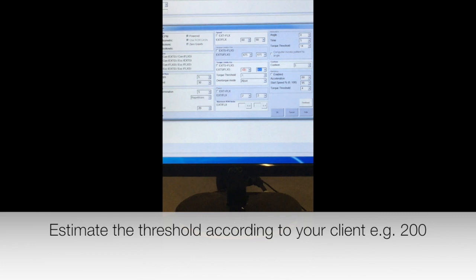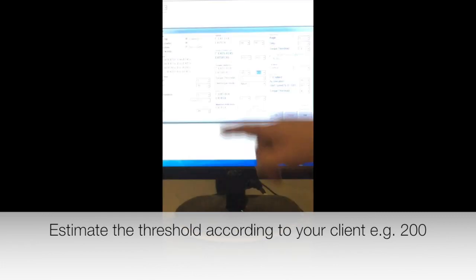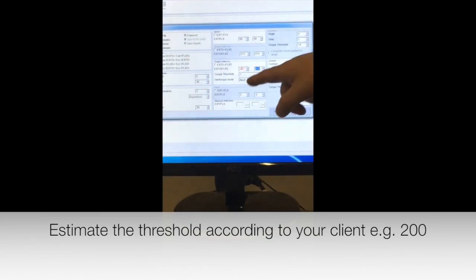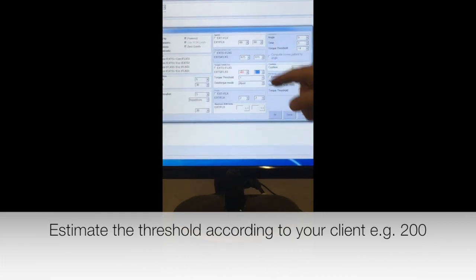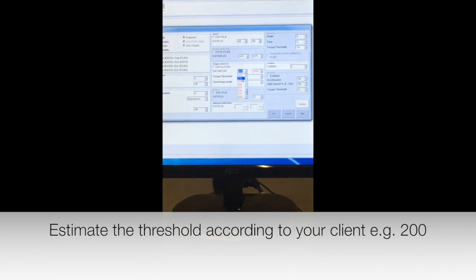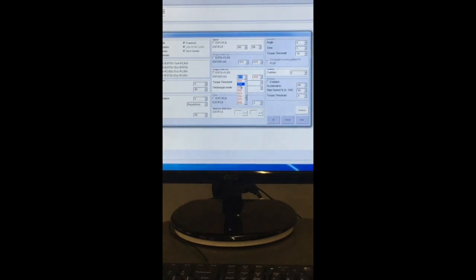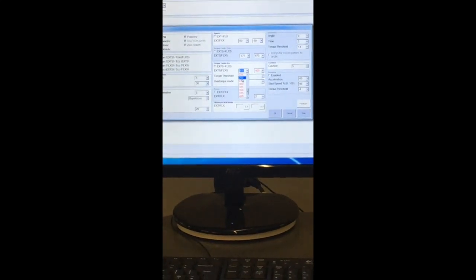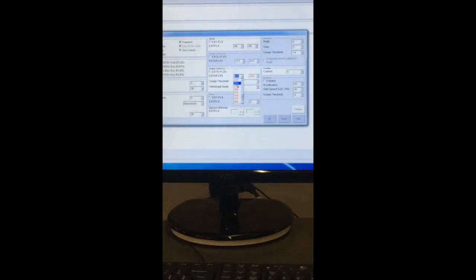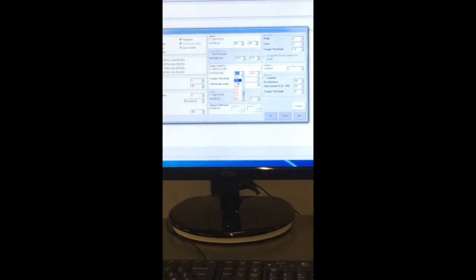But the machine will warn you that you've selected high torque settings. The machine will move that subject at that force, or near to it, or allow them to get up to that force. So it's quite high. So you might want to start around 200, 250, something like that, for example. And if they trip the machine, restart the test and then just knock the torque setting up one until they don't. So it might take a little bit of playing around. Okay. Do not go right for 400. You've got to sort of gauge where the safety is.